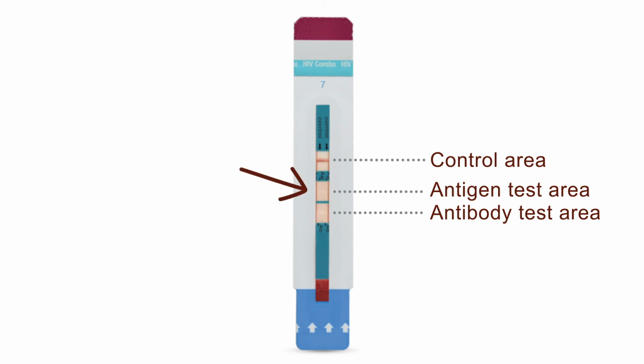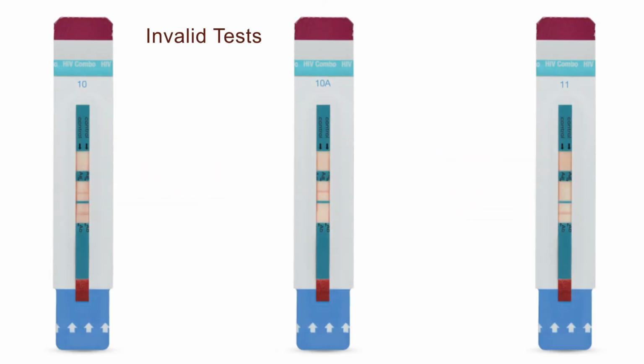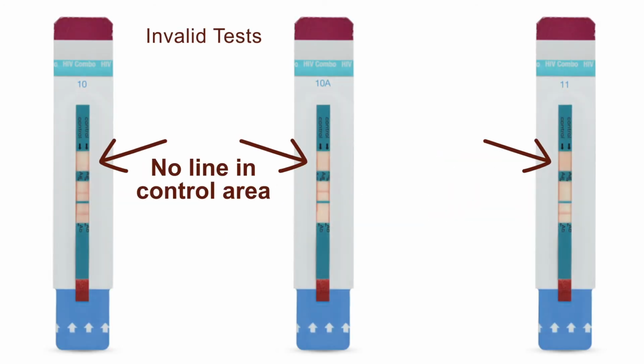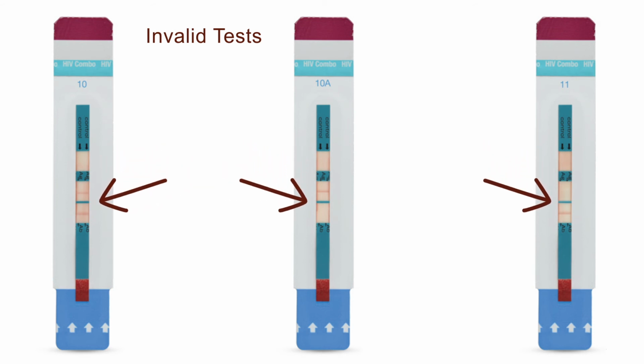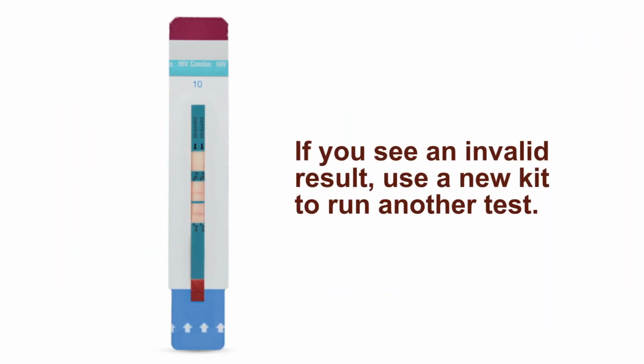No line in either of the test areas indicates a non-reactive result and indicates that HIV antibodies and antigen were not found in the sample. A non-reactive or negative result reliably shows the client's HIV status as of 90 days prior to testing. You have an invalid test if you don't see a line in the control area, even if you see lines in the test areas, or if the lines don't go all the way across the strip. If you see an invalid result, use a new kit to run another test.